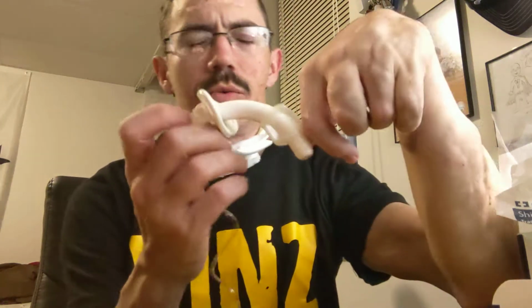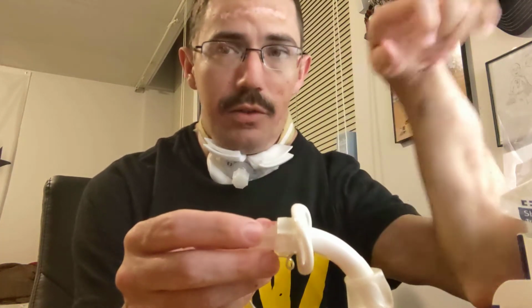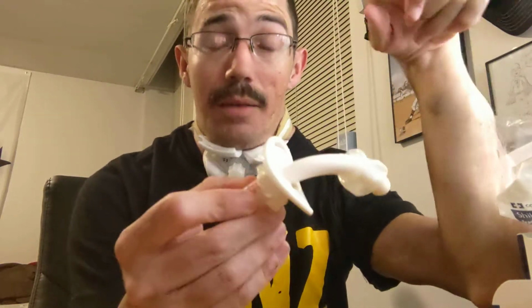that's how a Trach works, just a quick rundown. But today I want to show you how to suction a Trach. A little bit of background: there's a foreign object in your lungs, and because of that, sometimes mucus builds up, because when things go into your lungs, mucus builds up to try to keep it from harming the actual lungs.